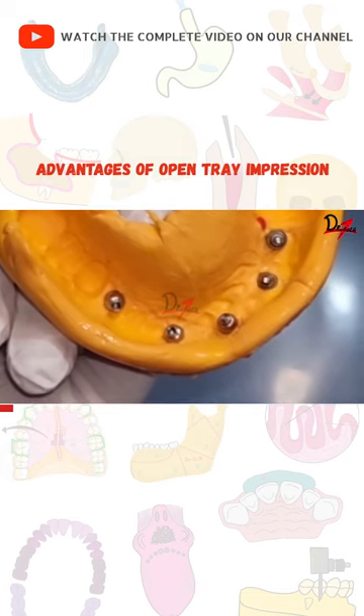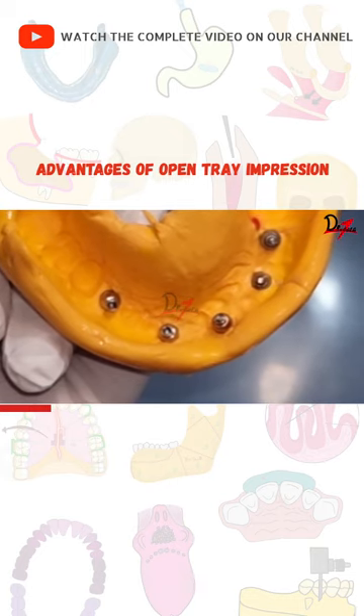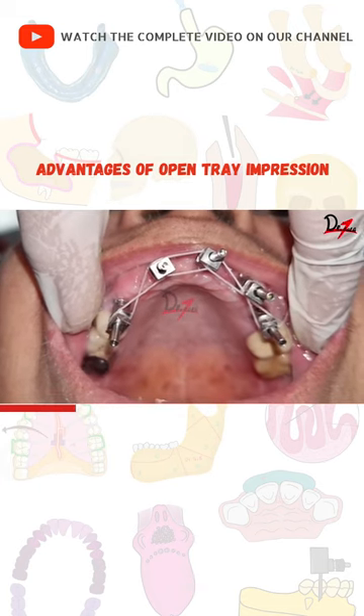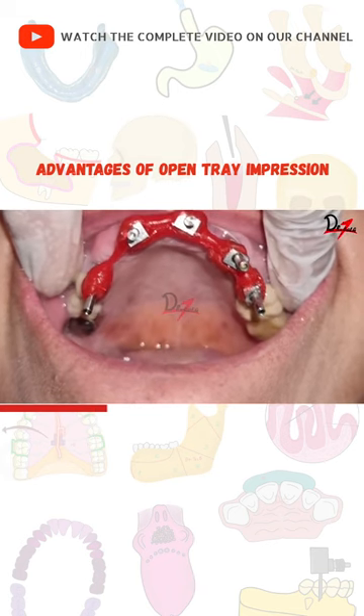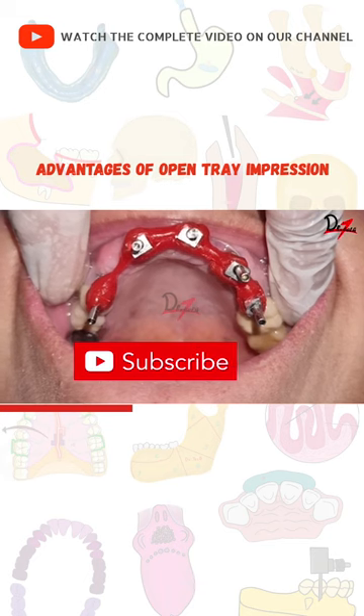The open tray impression technique is one of the most accurate methods of making an implant impression. We can also splint multiple open tray impression copings using pattern resin, which will further improve the accuracy.